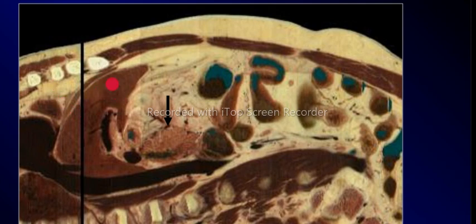Remember, we are at the midline, but slightly to the right. And we are seeing the head of the pancreas here. It's the widest portion of the pancreas. Then we have mesenteric fat superimposed. This is transverse colon, a bunch of small bowel loops, as you can see. Then we have muscles of the anterior abdominal wall. Here we are looking at the subcutaneous fat, skin, and the depression of the umbilicus beginning to show.